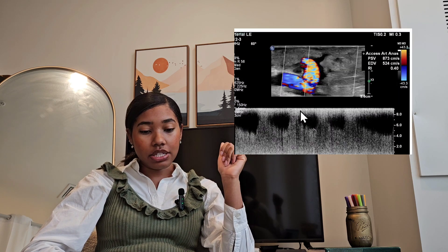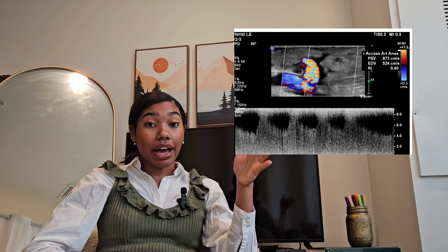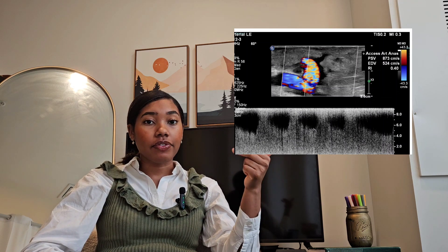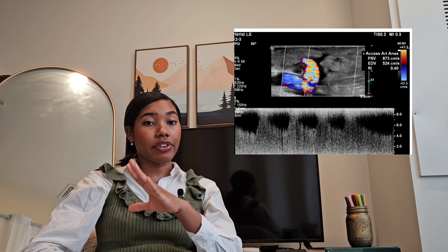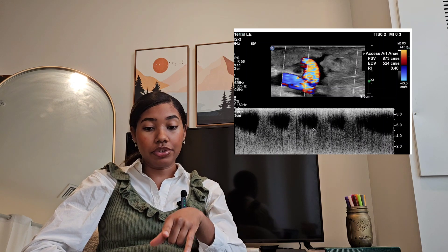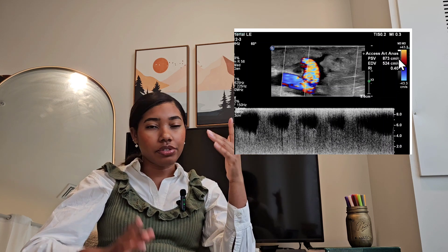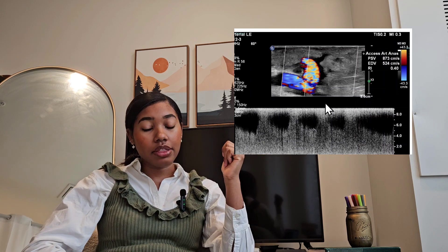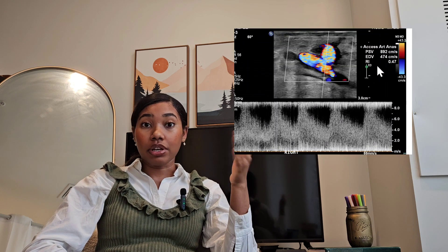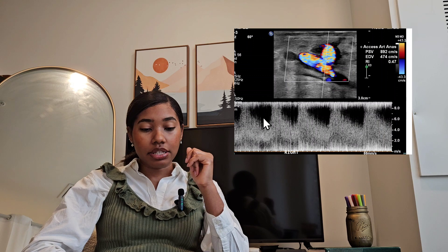I'm getting high velocities here. I retook measurements and got high velocities again. According to the IAC, at an anastomosis, if there's a tripling of velocities, that qualifies as greater than 50% stenosis — it's tripled for an anastomosis of a fistula. Previously it was 229 centimeters per second, and afterwards it was almost 900, which is more than three times the velocity. So you take the proximal anastomosis measurement. Because of the 2D image, I know where the anastomosis is with the artery, so I kept my angle in that same direction.